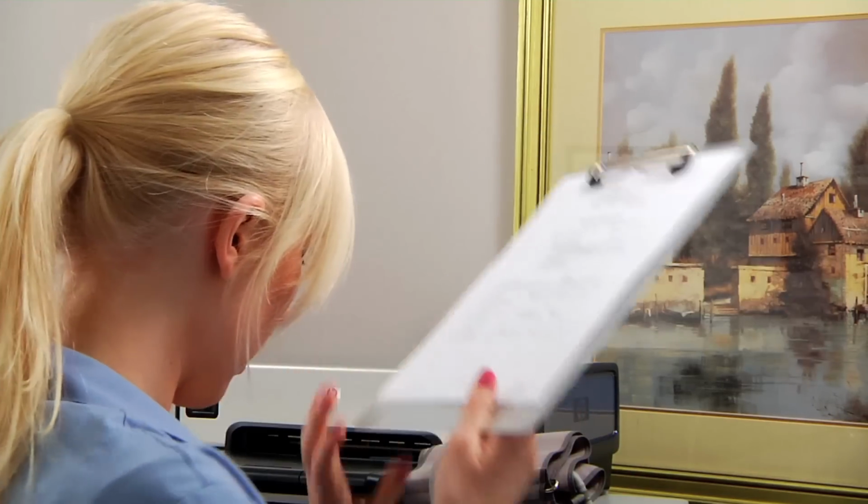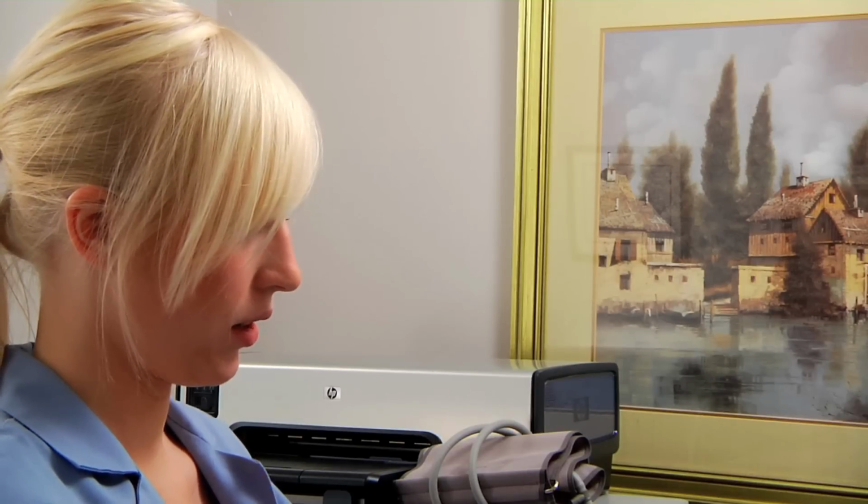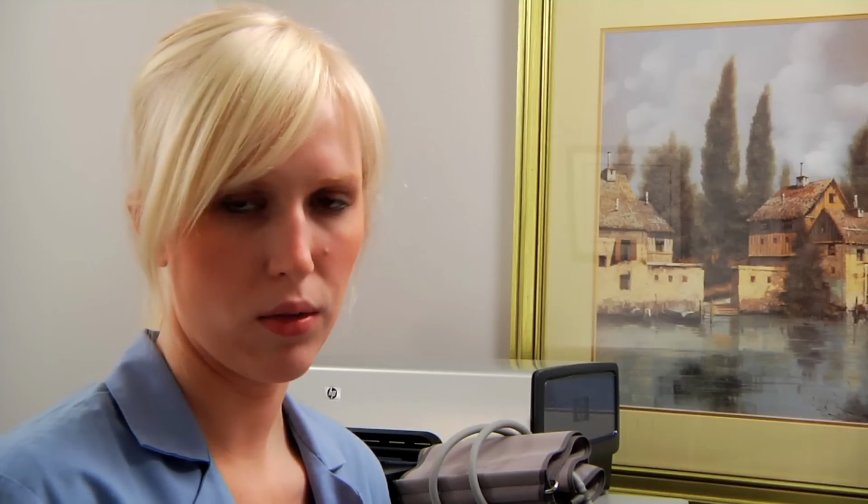I then look at my screen and I write down the blood pressure, systolic, diastolic, and the heart rate. I just like to write it down right here on the testing sheet so that the doctor can see it briefly when he's initially meeting the patient.